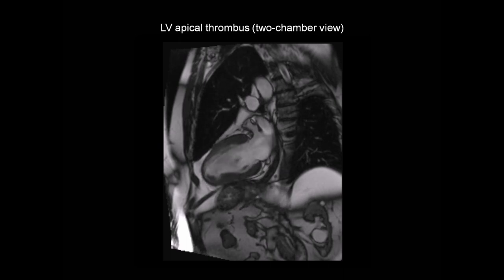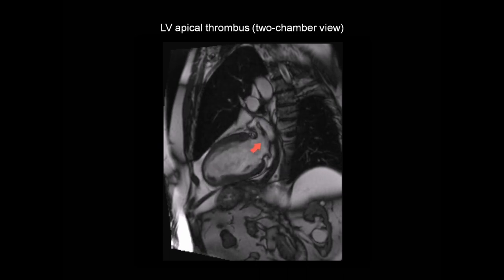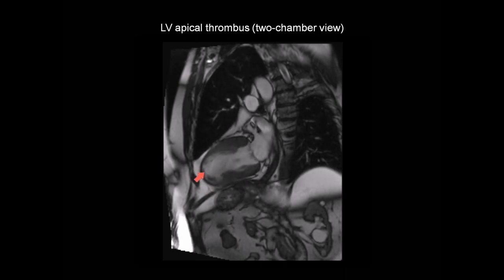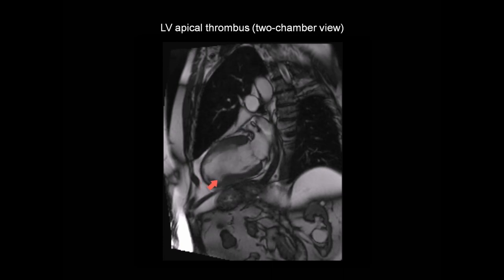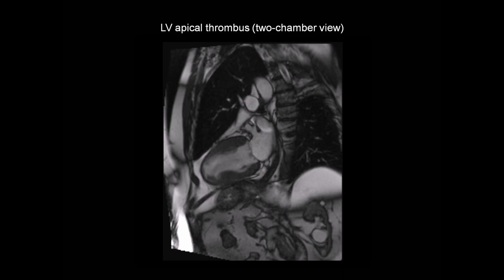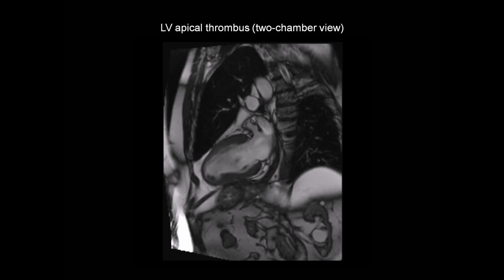Here's the same patient — this is their two-chamber cine-CMR image. Here's the left ventricle, mitral valve, and left atrium, and here's the left ventricular apex. And this time, I'm much more suspicious. Looking at the apex, there's this area in the apex just sitting here, which looks very suspicious of an apical thrombus. But to try and prove this, let's take a look at the equivalent late gadolinium enhancement image.